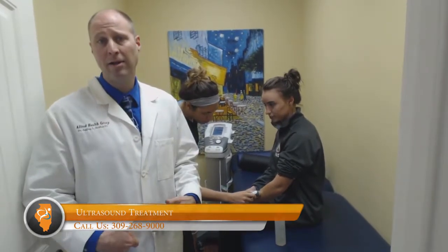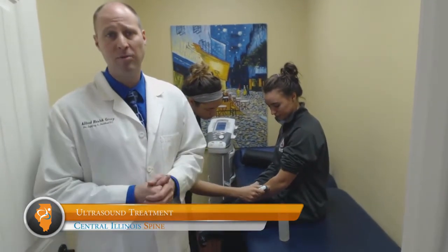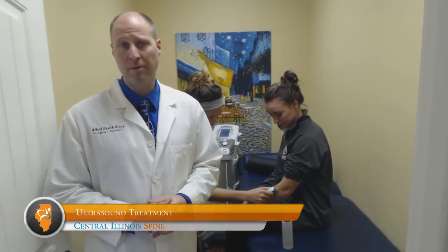It can be used on a lot of different body parts — the neck, the low back, knees, plantar fasciitis, shoulder problems. A lot of different places respond very well to the ultrasound treatment as part of a treatment plan.